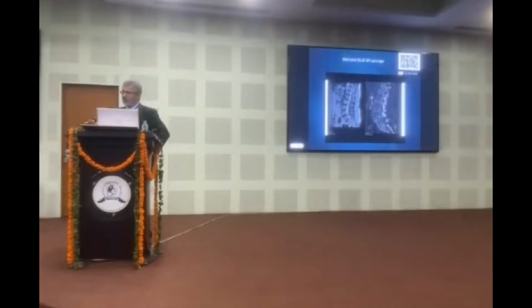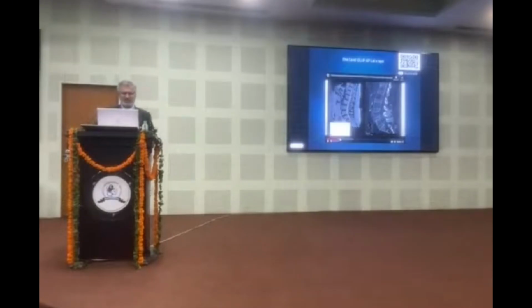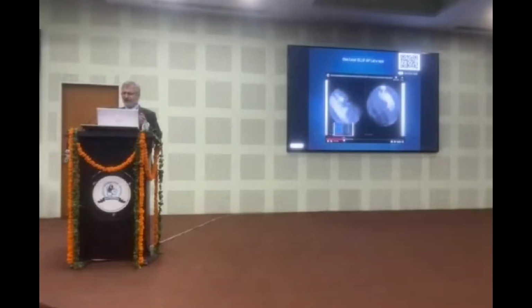Let me just tell you, more than 90% of them tell you that when they woke up, the leg pain was gone. That means that by restoring the height of the disc, you could get rid of the symptom of compression on the nerve, right? Without actual decompression. So here you see an isthmic spondylolisthesis. I'm just going to move forward a little here so we see the actual surgery. The beginning of the surgery is orienting the films with regard to the patient. It's very algorithmic.